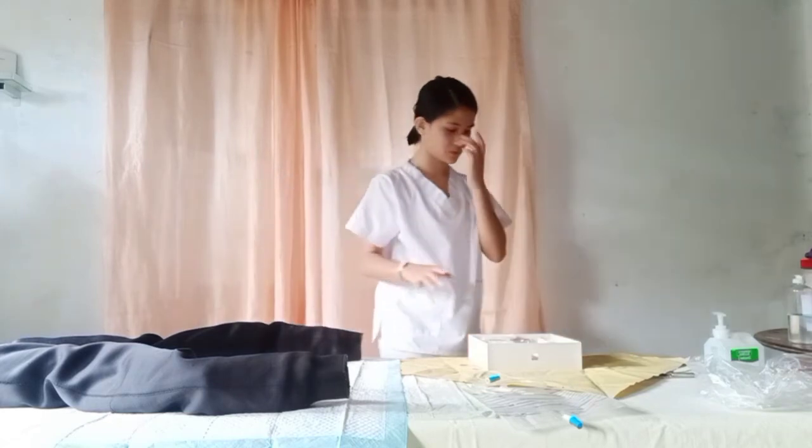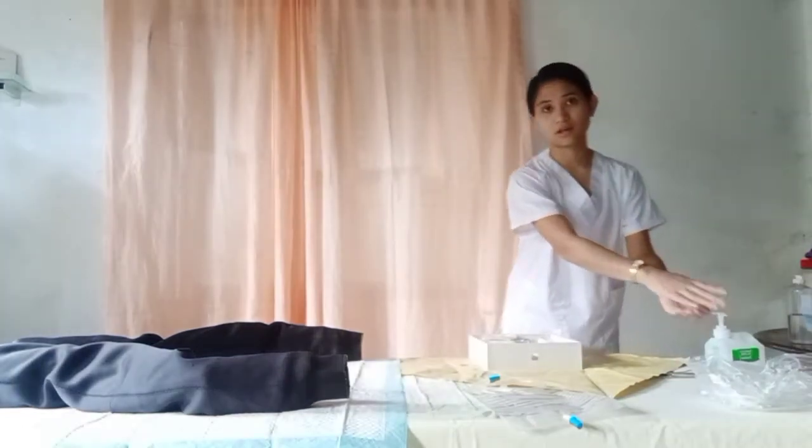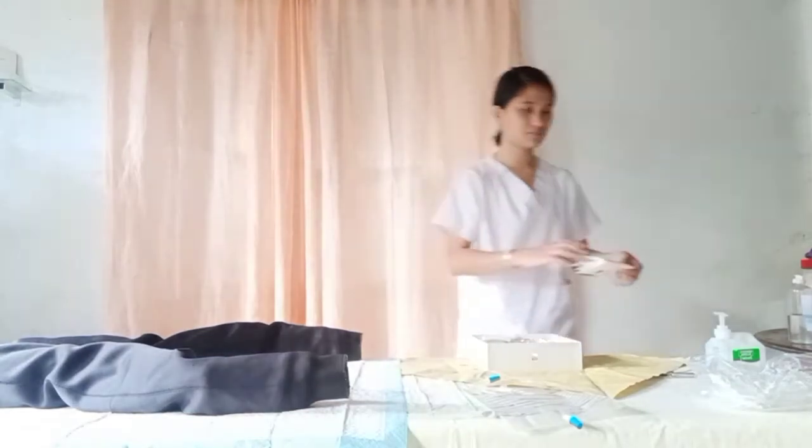Still assuming that the patient is in a lithotomy position, now I'm going to apply the gloves, which are also sterile.